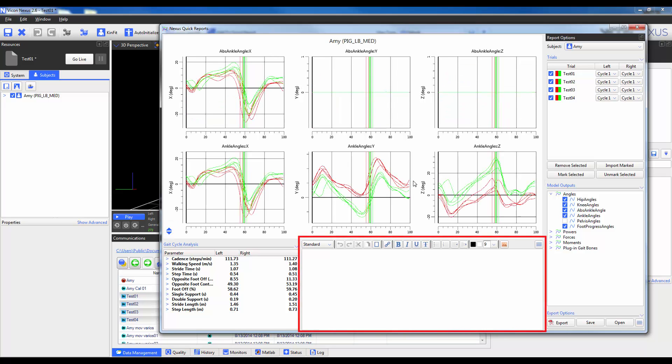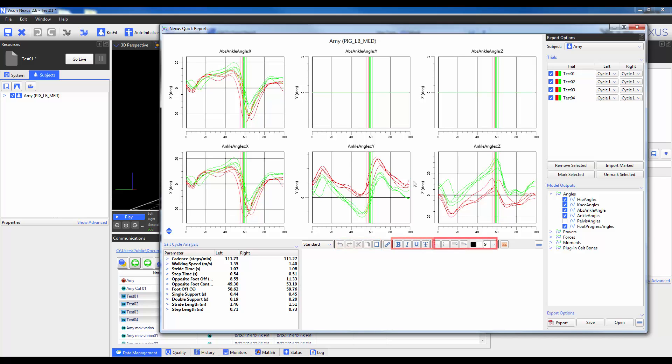At the bottom of the interface there is a text window which functions as a very basic word processor. You have your clipboard, font and paragraph options as well as the ability to import a picture. You can hover over each icon to determine its exact function. The last icon is the ability to add a URL to the report.